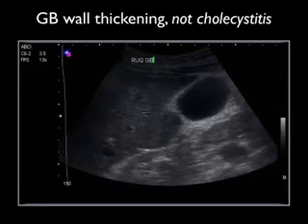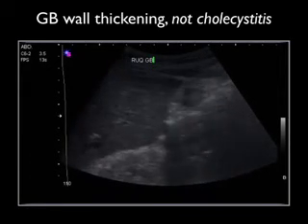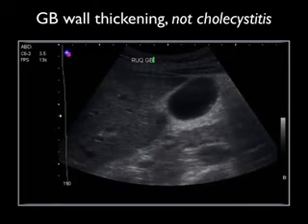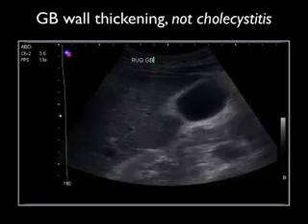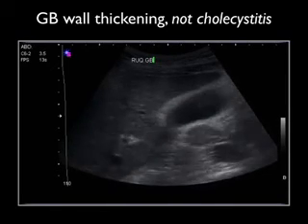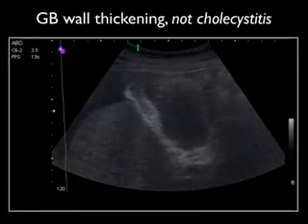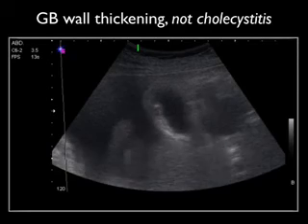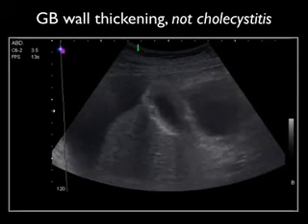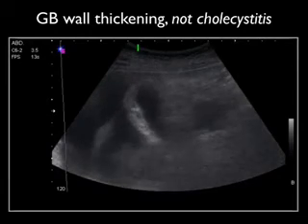This is the same patient as we're scanning from the patient's fundus all the way up to the neck of the gallbladder. And you can see that the wall is quite thick, but this is due to a medical cause. In this patient who has cirrhosis, we see a significant amount of ascites, so fluid around the dome of the liver, and then we see a markedly thick gallbladder wall. Again, a medical cause for gallbladder wall thickness.